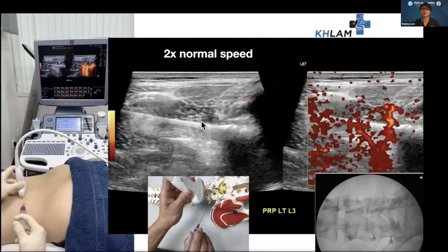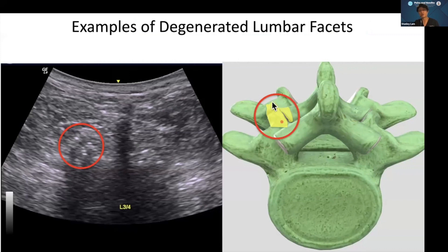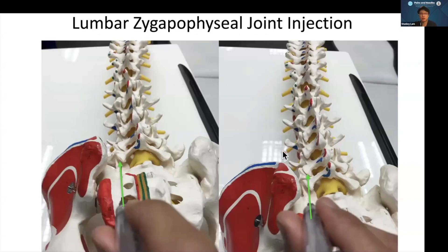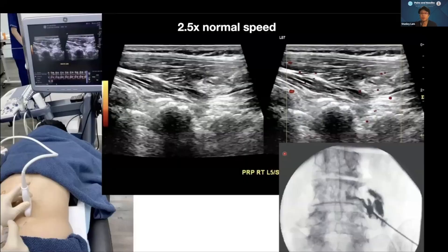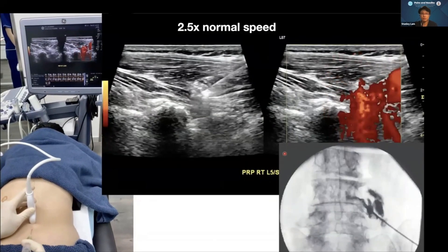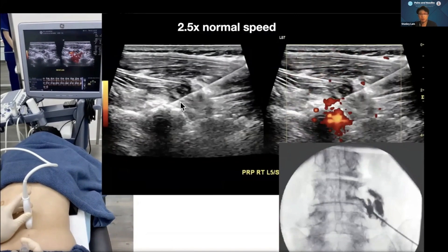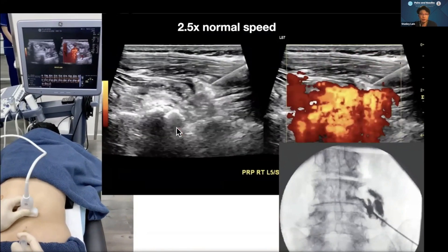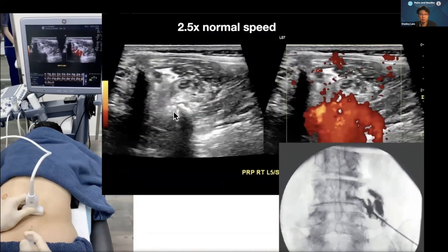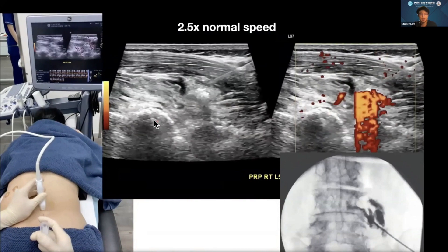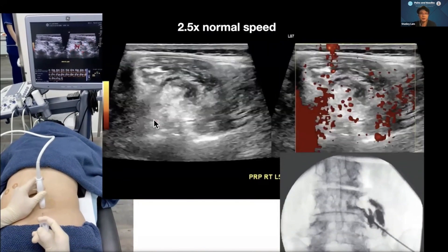If you're facing a patient with a very tall superior articular pillar, the lateral-to-medial approach, even going intra-capsular, probably cannot treat the intra-articular part of the facet. That's why I have the needle coming from caudal to cranial. I go in-plane first, also treat the multifidus, then go between the superior and inferior articular pillars, and turn the transducer 90 degrees to prove that the needle is intra-articular.